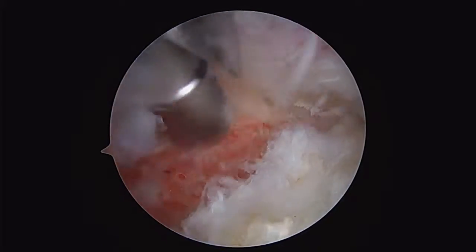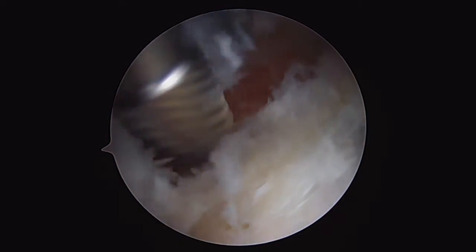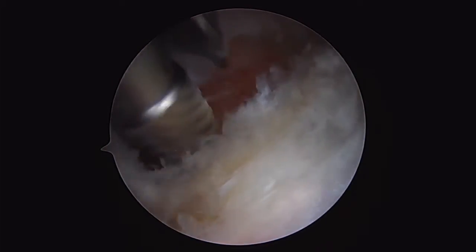Once we've got our lesion exposed, we'll go ahead and take down the pincer lesion with a high-speed burr. We have almost complete detachment of the chondrolabral junction, and more anteriorly, we have complete detachment.